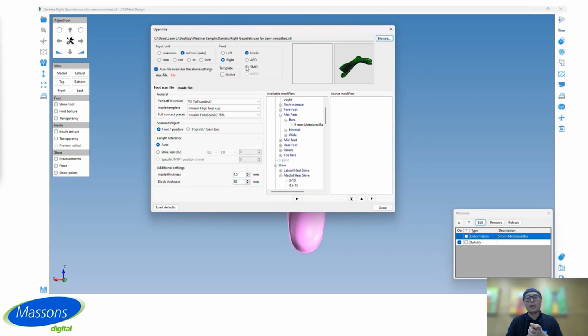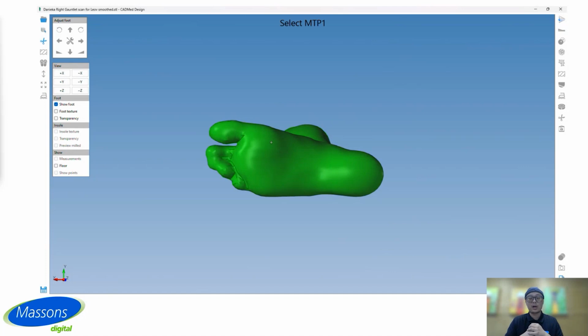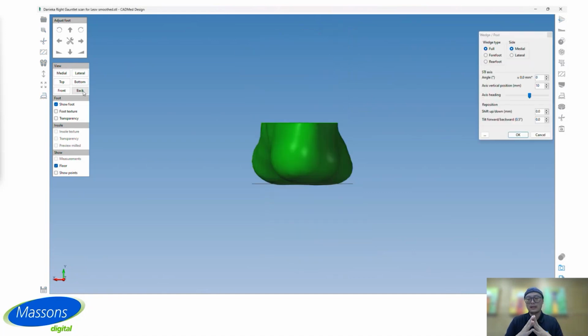During the import step, we can see that there are many options to choose from. You can adjust settings based on your needs. I will provide a detailed introduction to this in our design webinar later. So after importing the scan model, I will mark reference points to help the software recognize the model and place it in the correct position. Then I will correct scan data as needed. You can adjust the perspective and the areas that need to be rotated according to specific requirements. Very easy, just click a button with what you want.